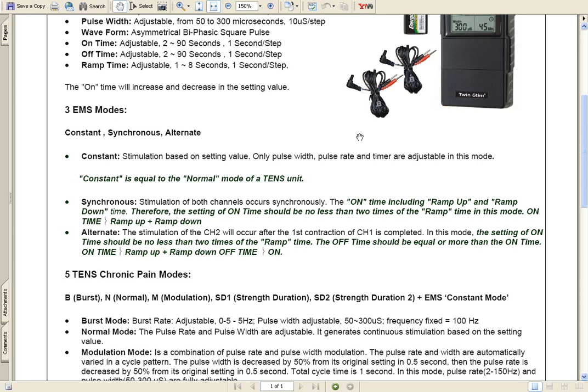It's like doing an arm curl very slowly. So you're contracting the muscle at the gym, using free weights or a machine, but you're not jerking on anything surgically repaired, soft tissue, maybe you have stitches, ligaments, tendons, whatever that's been surgically repaired. You don't want to be yanking on it. So you want it to go very slowly up to full power. So let's say your ramp on is 8 seconds. It's going to go from no power to full power over 8 seconds.